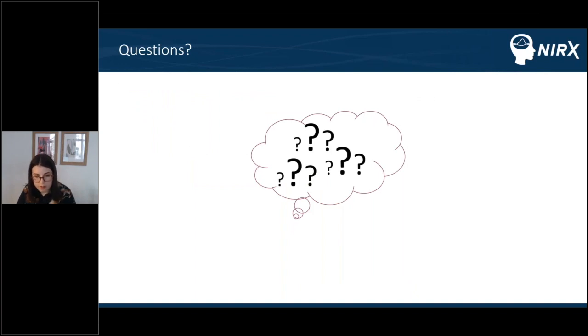So this part of the introduction to Homer3 is finished. If you have any questions about the interface, we could address them.